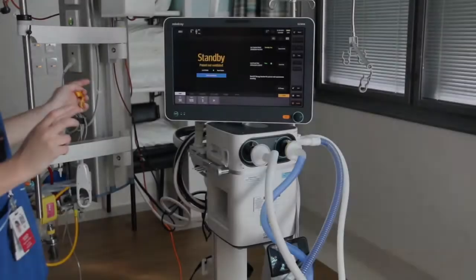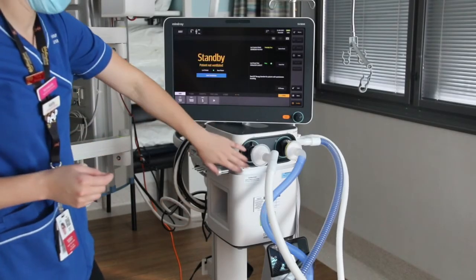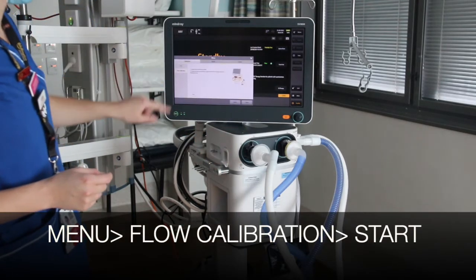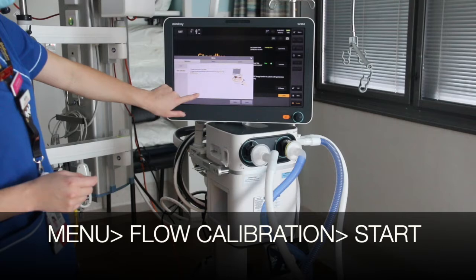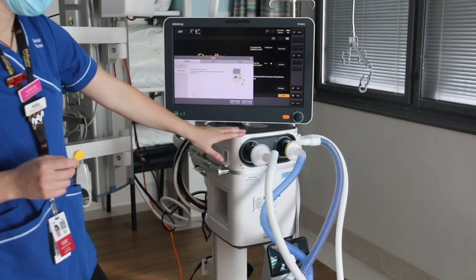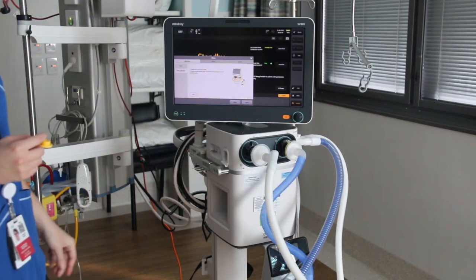The first thing that you want to do is from the main screen calibrate that flow sensor like we talked about. So you're going into menu, flow calibration, and hitting start there. That's your first check to marry up the flow sensor with the ventilator. It takes about four minutes and is quite noisy.